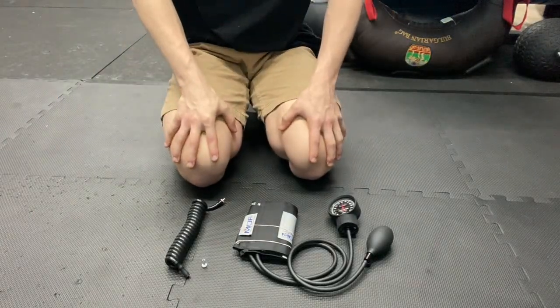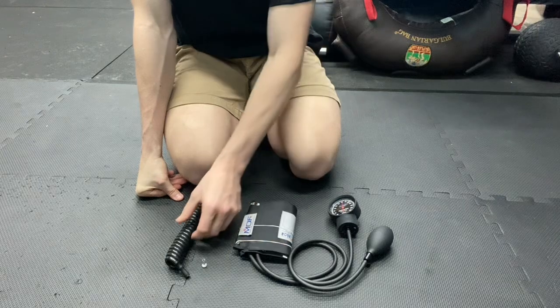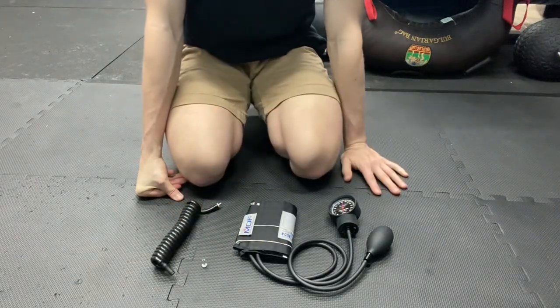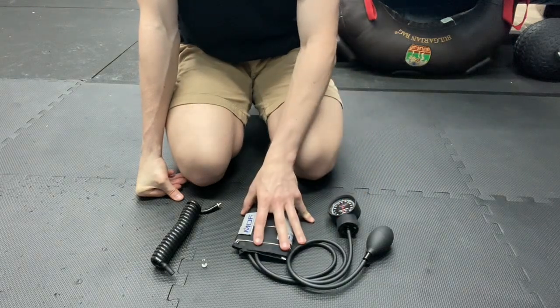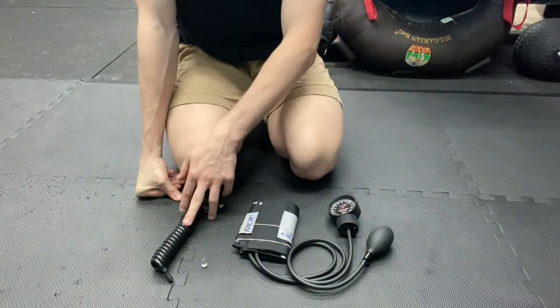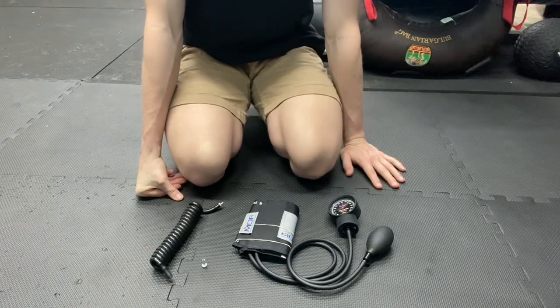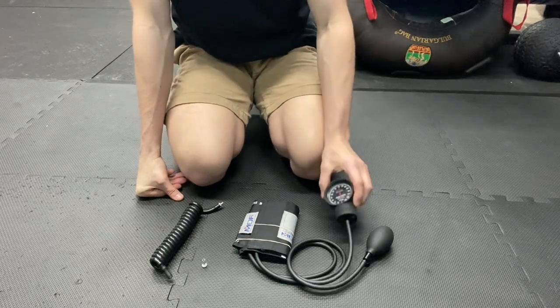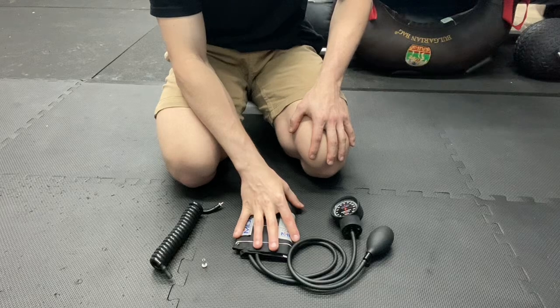All right, today I'm going to show you guys how to put together a blood pressure cuff and an extension hose. Anyone that's getting into the lower abdominal exercises and you need a blood pressure cuff, the extension hose is highly recommended for those exercises, so to make it a little bit easier on you and have less stress in your neck. So to do this, you're going to need to get your blood pressure cuff.